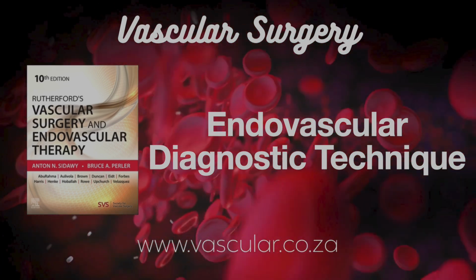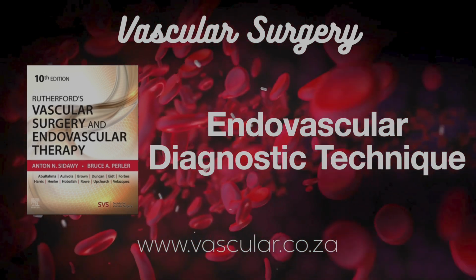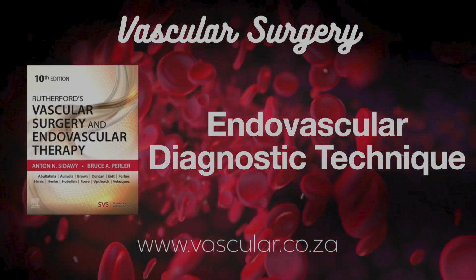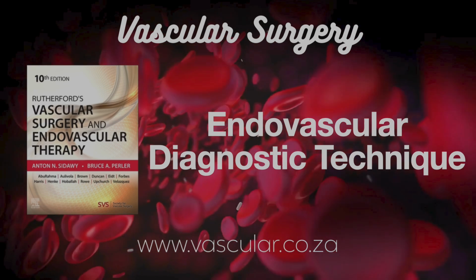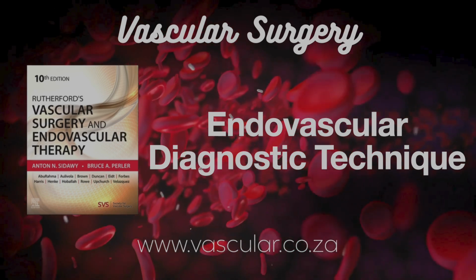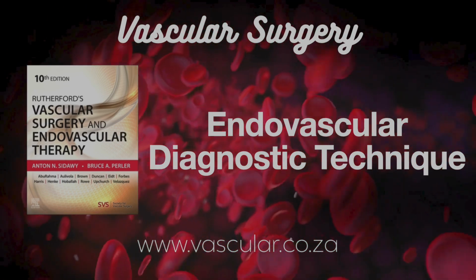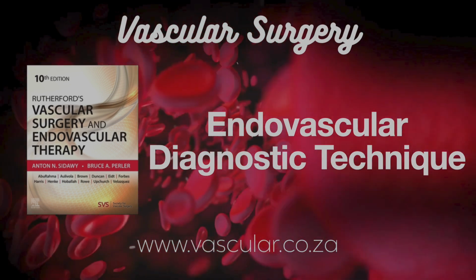What about super stiff wires? They can be risky, especially if they have a sharp transition from floppy tip to stiff body. They're rarely needed for just diagnosis. If used for intervention, it's better to advance them through a guiding catheter for protection. How are dissections or perforations managed if they happen? Significant dissections might need angioplasty or stenting. Perforations, or AV fistulas caused by the wire, might need a covered stent if causing major bleeding.